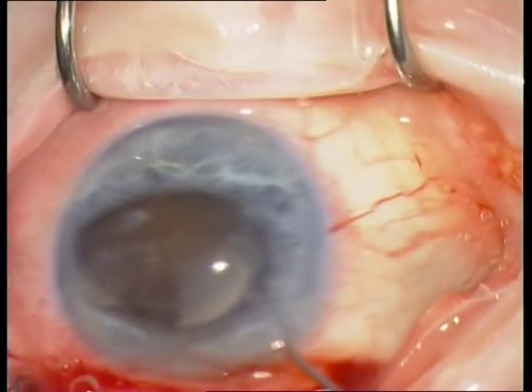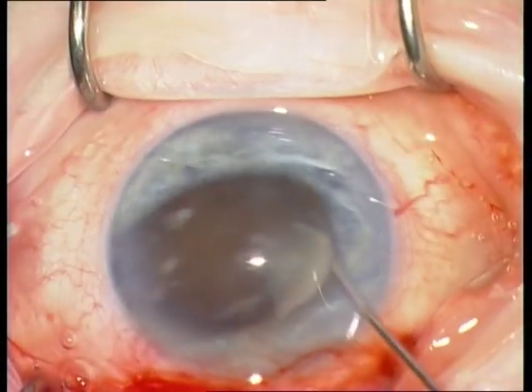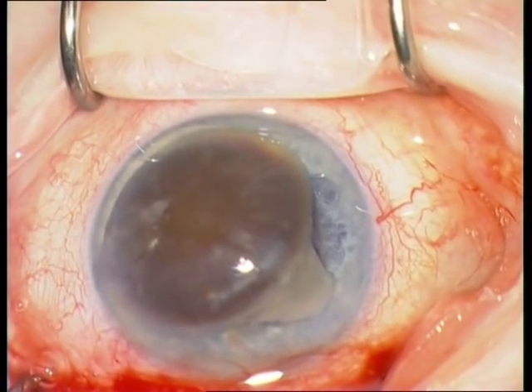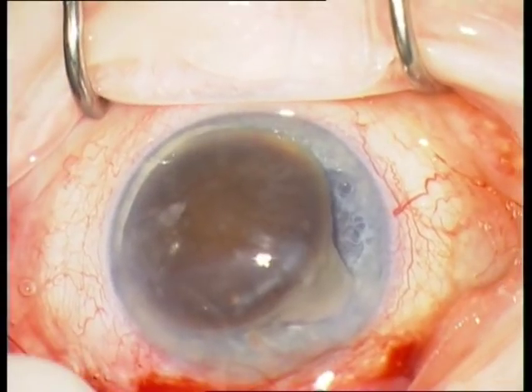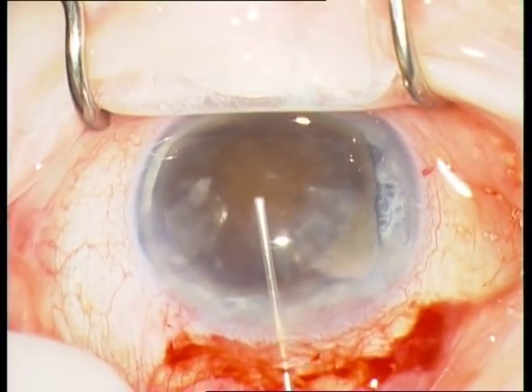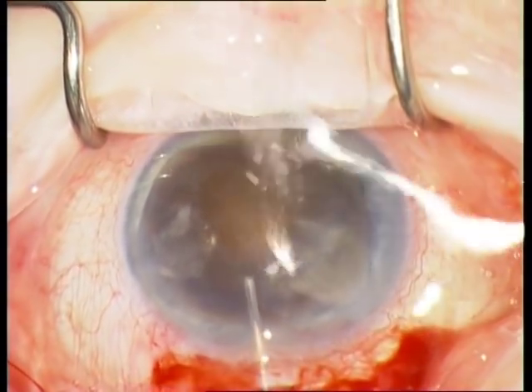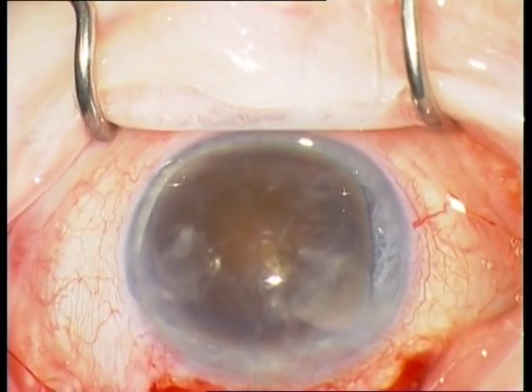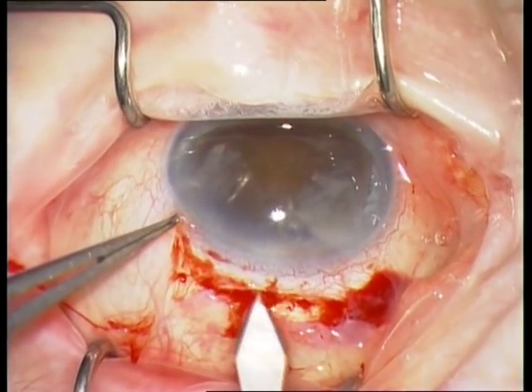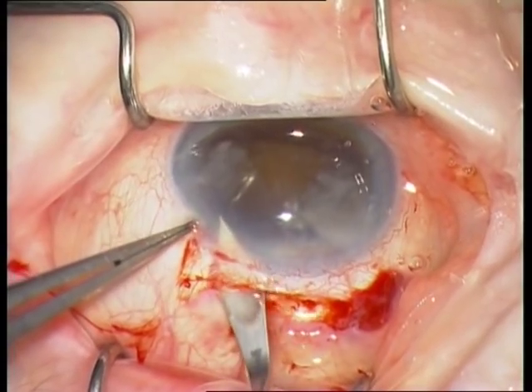I am using again on the right side a push-pull instrument and rotate the nucleus into the anterior chamber. Again, inject viscoelastic between the nucleus and the endothelium and between the nucleus and the posterior capsule in order to protect the endothelium and the posterior capsule.